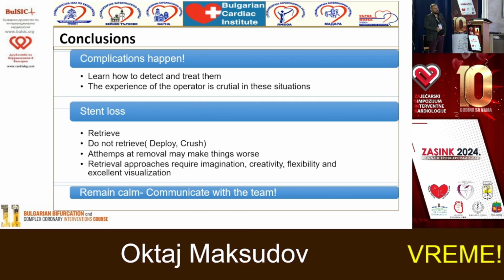When there's a situation of stent loss, we should retrieve, do not retrieve, deploy, crush, and attempts of retrieval may make things worse. Retrieval approaches require imagination, creativity, flexibility, and excellent visualization. When this kind of situation happens, you must remain calm and communicate with the team.